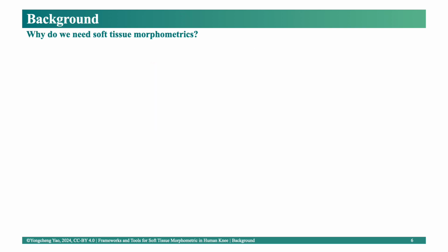You might wonder why we need soft tissue morphometrics. Aren't imaging techniques like MRI sufficient for soft tissue analysis? The answer is probably no. Since morphometrics can provide quantitative measurements, it is desirable to derive these metrics from medical images.